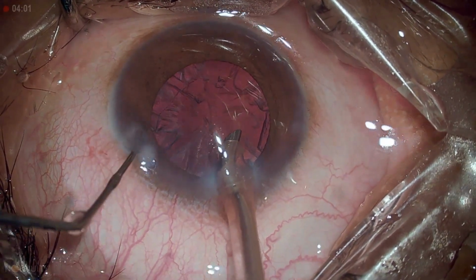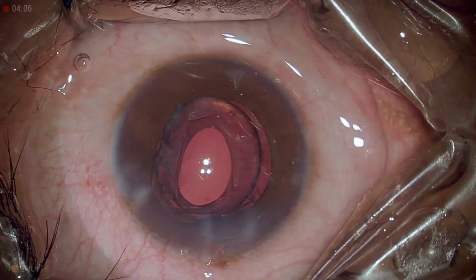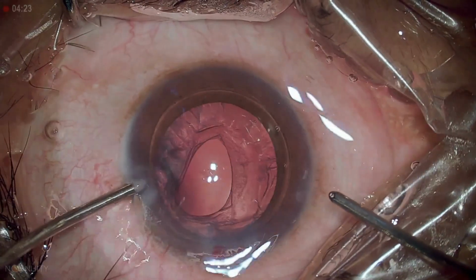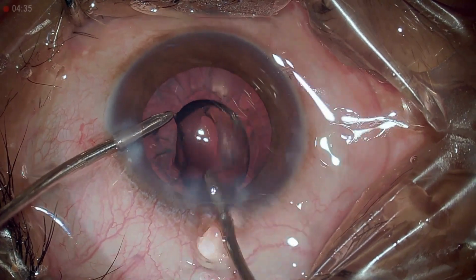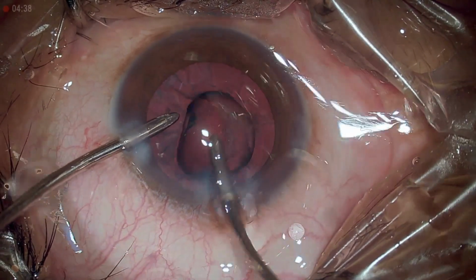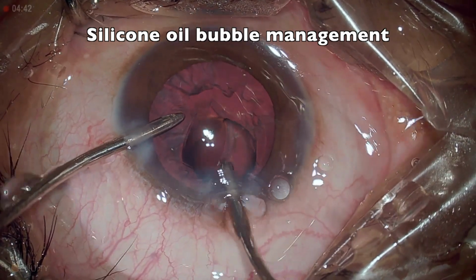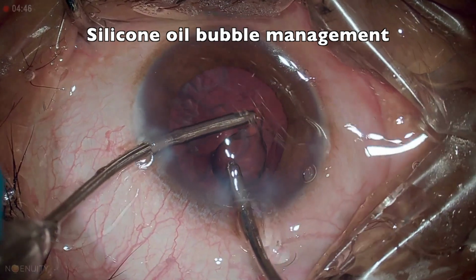So thinking probably that there is no rent, I just came out, and there you see we have a nice big rent, and the silicone has entered into the chamber. The moment we form the chamber, we are able to remove some part of the silicone bubble. But what we realized was the more we press, the more the oil comes out.